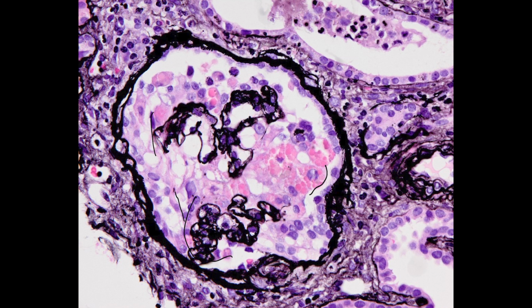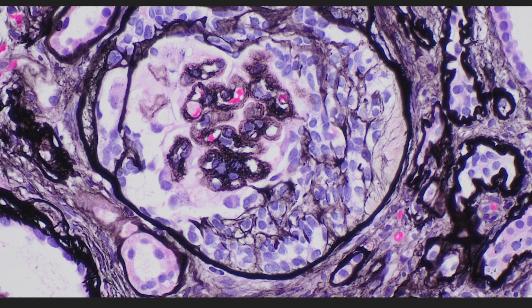Were there any other glomerular changes like endocapillary hypercellularity or crescents? No, we didn't have any crescents, no proliferation, but we can see on this glomerulus, using the Jones stain, that there were actually quite a bit of holes within the capillary loops. Interesting. How about immunofluorescence? What did that show?